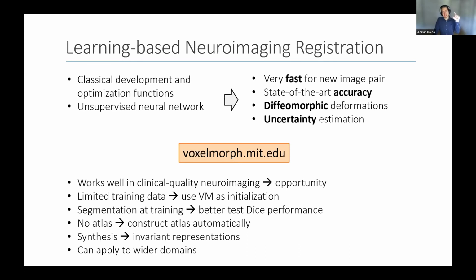I rushed through it. That was this clinical section I had a couple minutes. So our stroke data was actually 1 by 1 by 6. And my opinion is that with a little care, it works better than the classical methods. I think it has to do a lot with the fact that it doesn't get stuck in as many local minima. It's really not that it improves all the images by 2 dice points, but rather that it avoids failure cases.